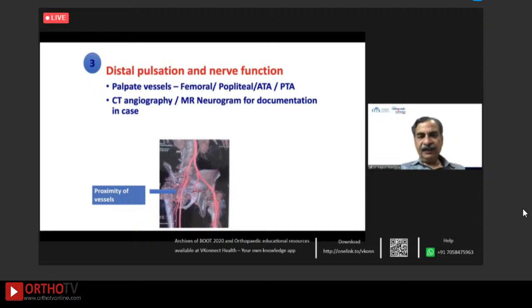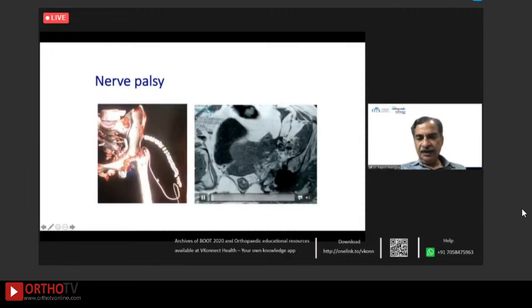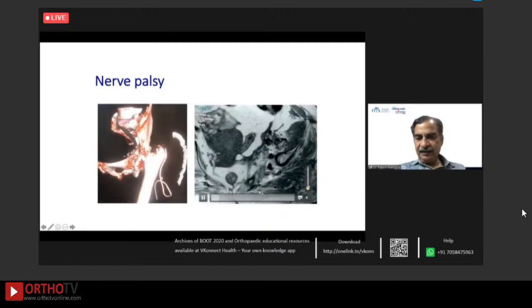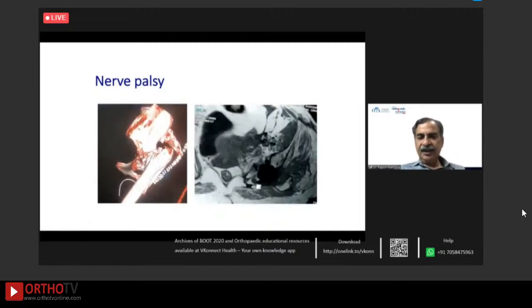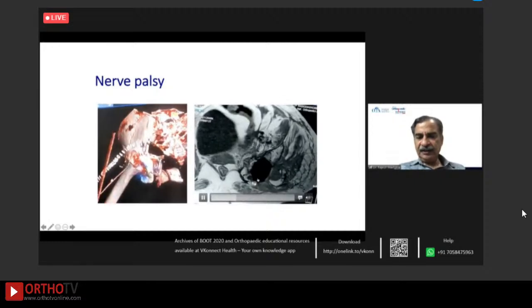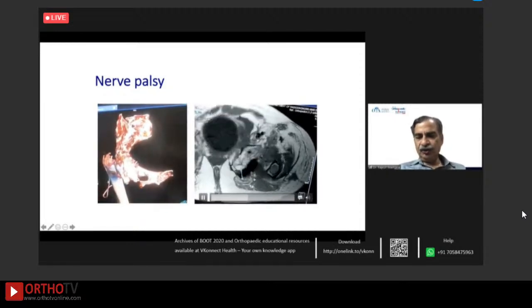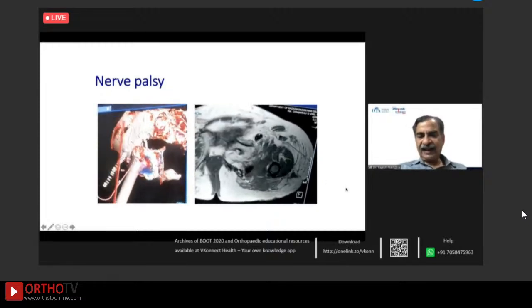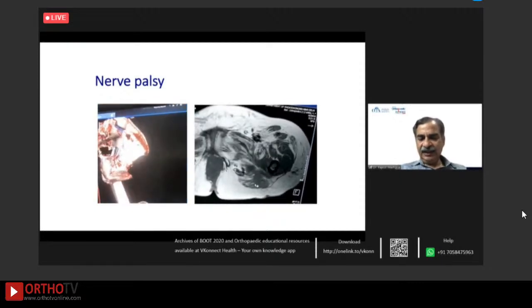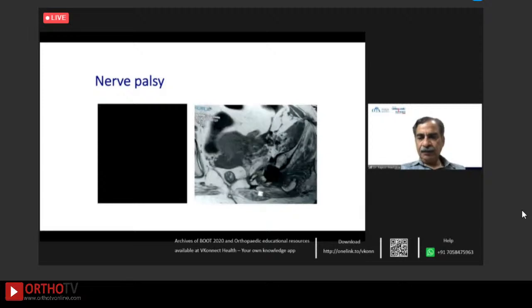The third rule is the distal pulsations and the nerve function must be ascertained. Palpate the vessels, all the peripheral vessels, do a CT angiography if required or MR neurogram for documentation in the case. So you can see in this particular case, see the proximity of the vessels to the implant. And this is a case where an MR neurogram was done. And for those who can understand Hindi, I think there's a short commentary when the radiologist is showing the sciatic nerve here, and as the scans pass, you can see actually it is quite close to the hardware. So it is possible to exactly map the sciatic nerve and see whether it's close to the hardware, and particularly if you find a palsy after any kind of surgery, we routinely perform the MR neurogram.